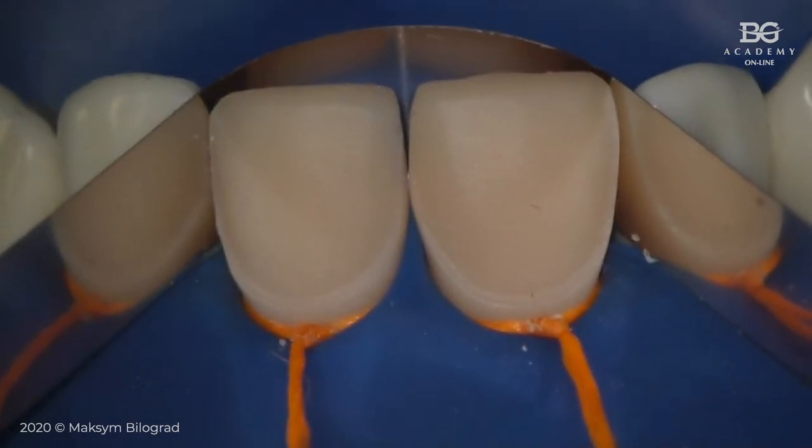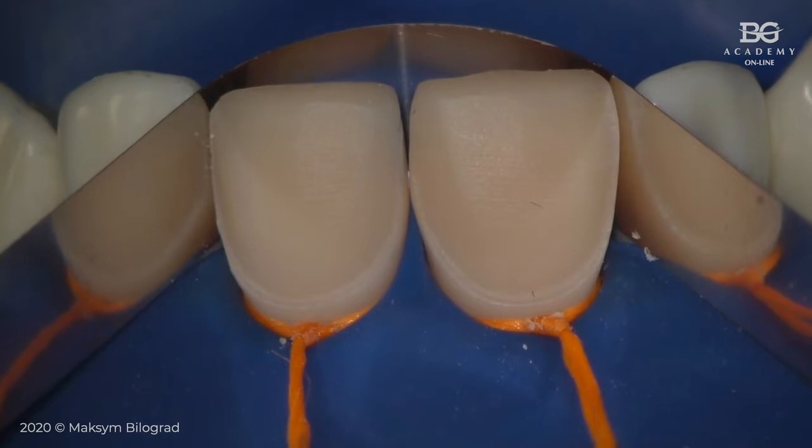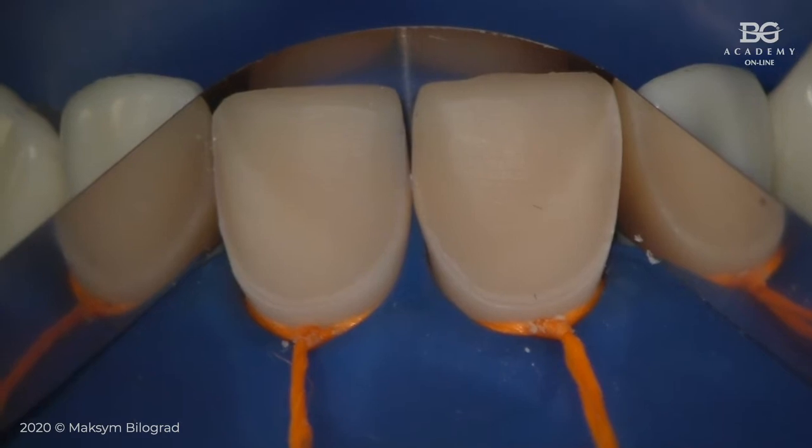Before I do sandblasting, especially if you have IDS area where you have some filling, in order not to re-expose dentin, sandblasting has to be really quick, like 3 seconds. Done. Okay, don't play too much with sandblaster because you can re-expose dentin again.